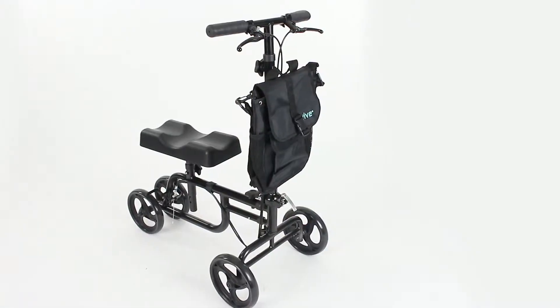Hi, I'm Devin. I'm the head of customer service for Vive Health and today I'll show you how to assemble and adjust your Vive Knee Walker.